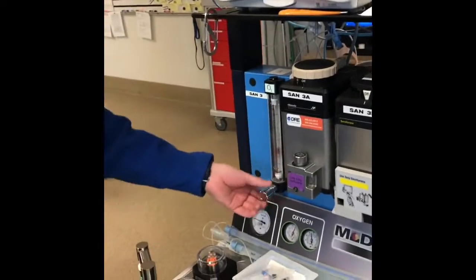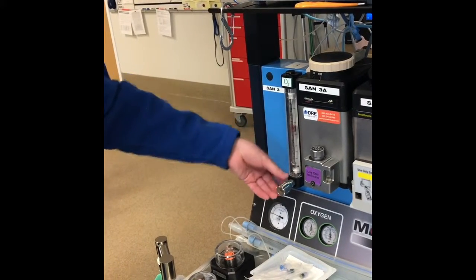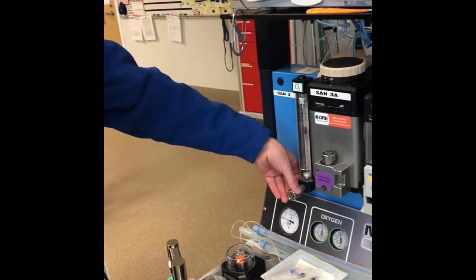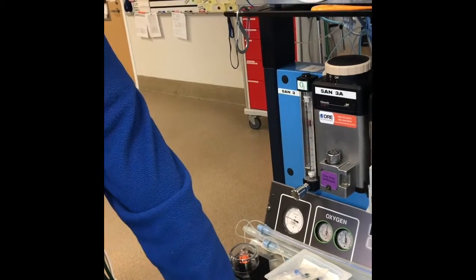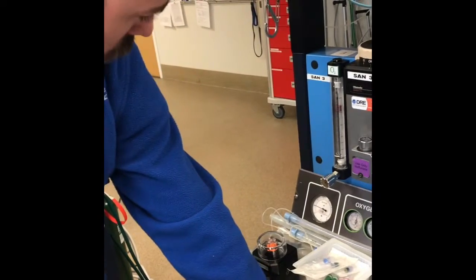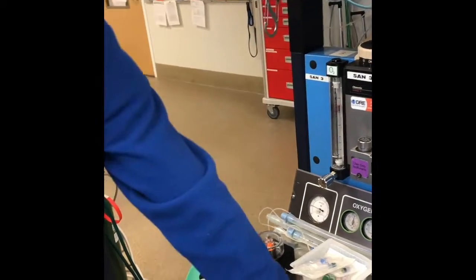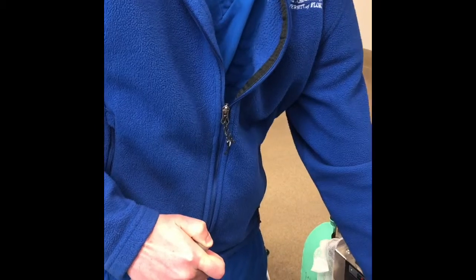That fresh gas inlet then connects to the inhalation valve, which then connects to the Y circuit and to the patient. The exhalation tube then connects to the exhalation valve.